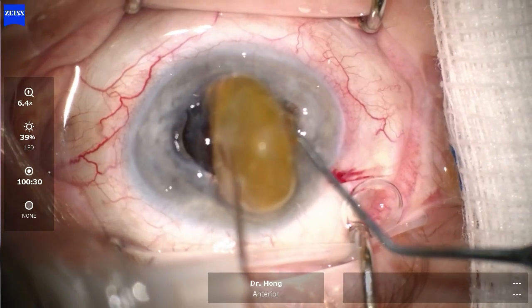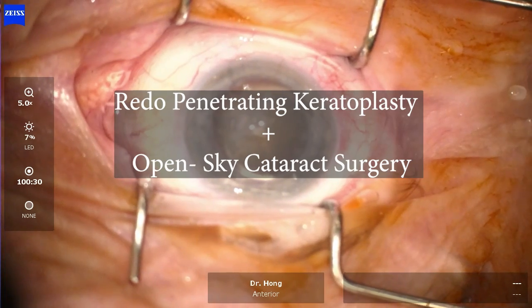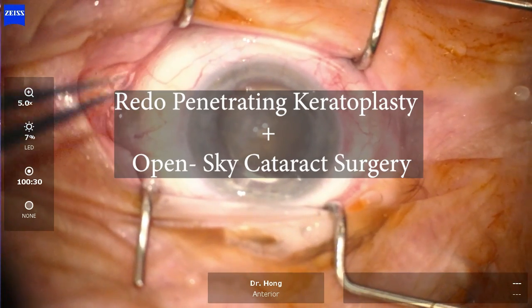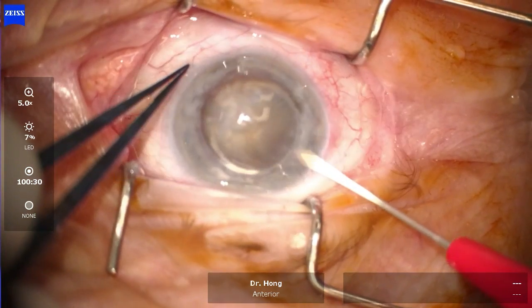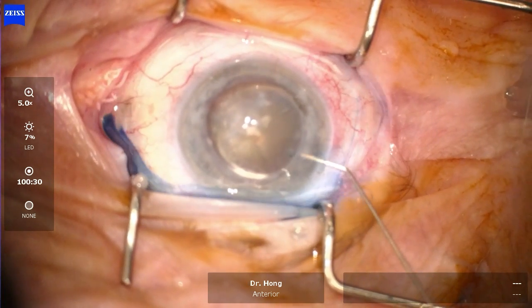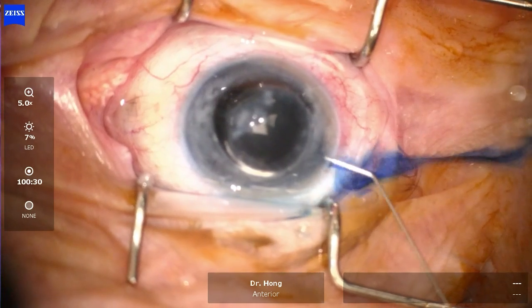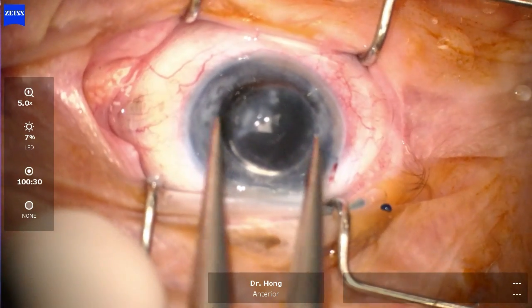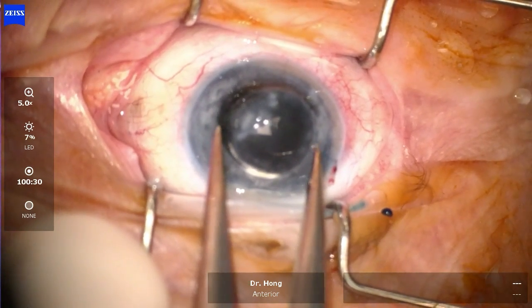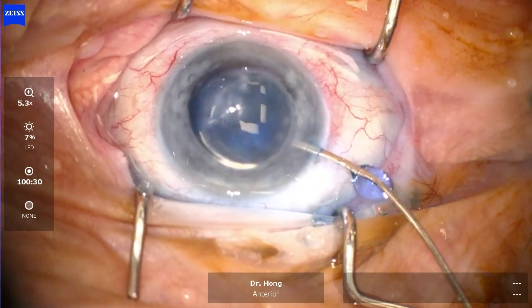We've got an interesting case of a redo penetrating keratoplasty in open-sky cataract surgery. This patient has had a previous penetrating keratoplasty performed over 30 years ago and the graft has started failing. The visual acuity has declined over the years from a baseline of 6/12 down to just light perception, and there was also an associated brunescent cataract.